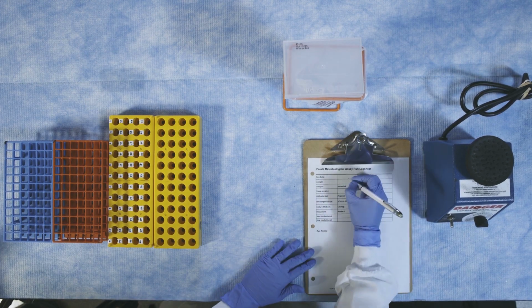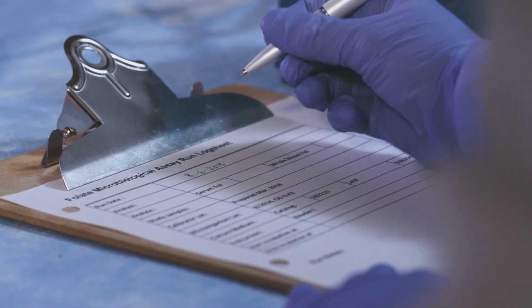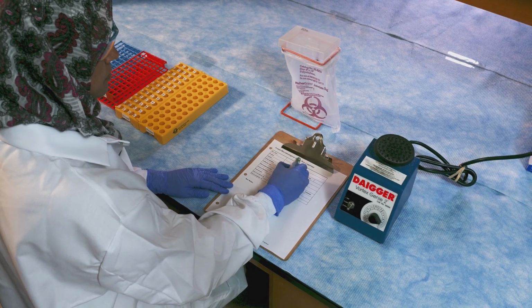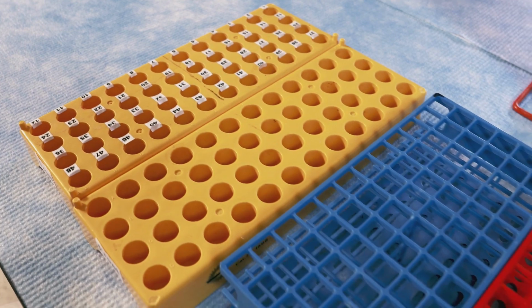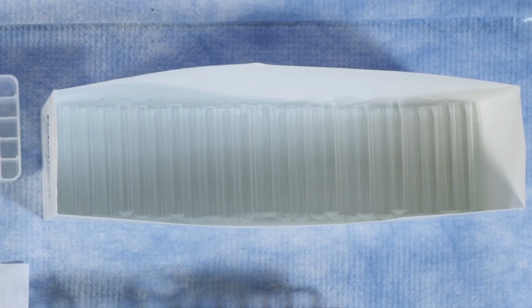Keep a run sheet to make note of medium lot number, calibrator lot number, sample dilution factor, or any other specific information. To minimize errors during sample dilution, use a parallel setup for sample vials coming from the collection site and for the glass tubes that contain the diluted samples.